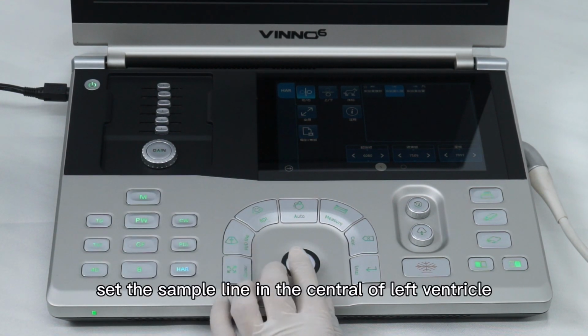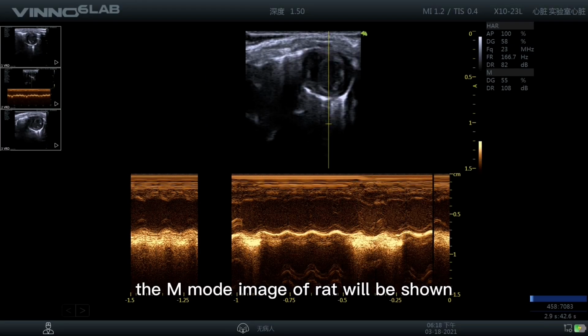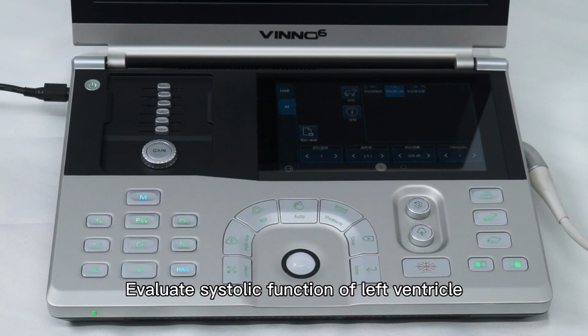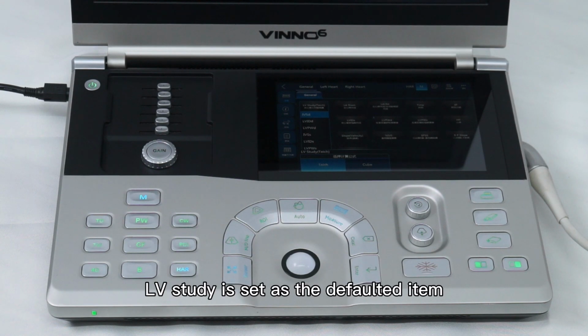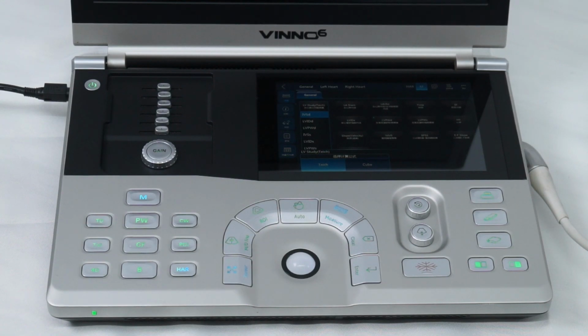Set the sample line in the center of the left ventricle. The M mode image of the rat will be shown. Evaluate systolic function of the left ventricle in the M mode image. Press the measure button. LV study is set as the default item. Fix these points on the M mode image.